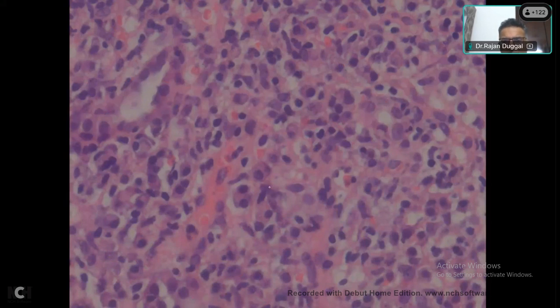So what do you think? What are these cells? A few mononuclear inflammatory infiltrate along with some plasma cells and plasmacytoid cells along with eosinophils. And possibly binucleated plasma cells. Lot of plasma cells, scattered. Occasionally scattered eosinophils. What else? You are seeing these kind of cells. These could be some histiocytic cells also. Less likely these are fibroblastic cells, but more like histiocytic cells.